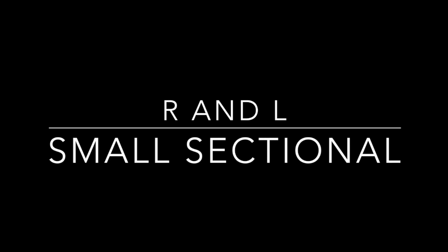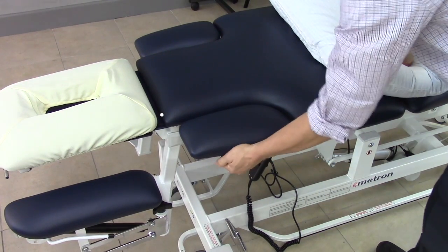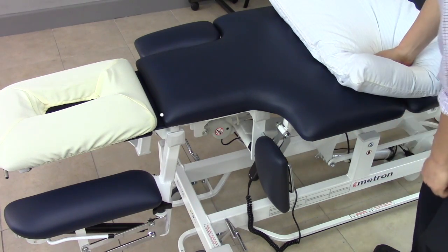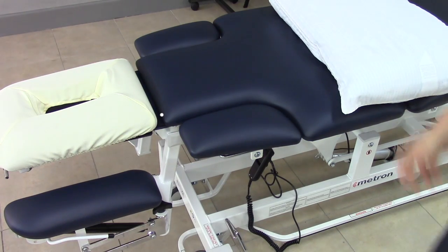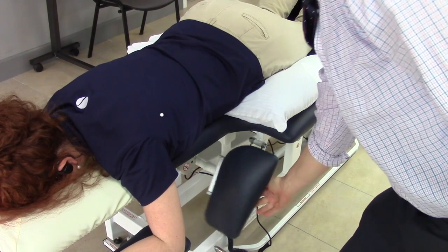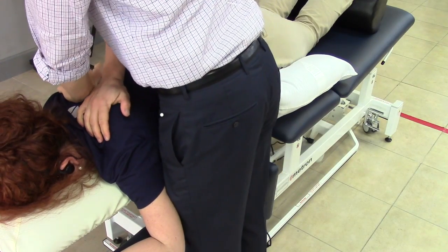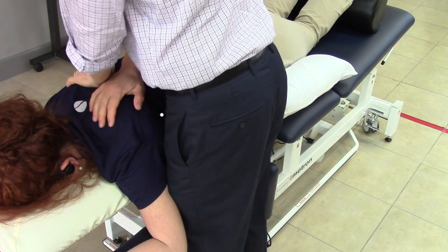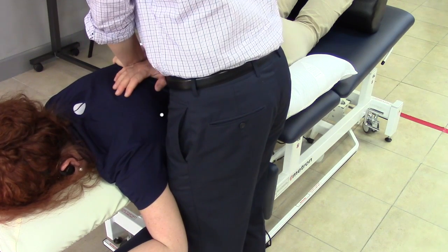Next we're going to look at the right and left small sectionals. On the left, you can pull out the metal bar and drop it down, then pull back out and re-engage. It's important to make sure the section is firmly secured. Dropping the small sectional allows you to get close to your patient, optimizing your forces during manipulations and protecting your body mechanics.